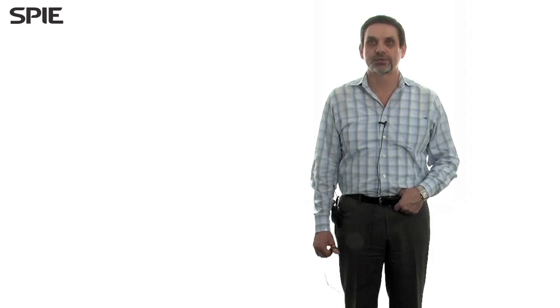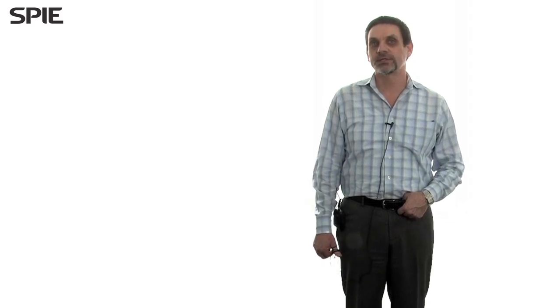And this market, if penetration is deep enough, will become larger than refractive surgery, which was the largest laser market. What is interesting is that the demand for the specific lasers that can perform this type of surgery, femtosecond lasers with tens of microjoules in energy and 100 kHz rep rate, did not exist. So demand was created by our development, and it created a new market where now there are several manufacturers and suppliers of these lasers that didn't exist before the need was created, and this became a big boost for the whole femtosecond laser technology in general. So this shows the dynamics that good applications create a whole niche of suppliers, not just the builders of an end product, but OEM suppliers, and it becomes a large industry.